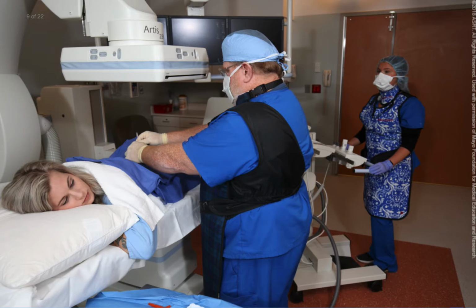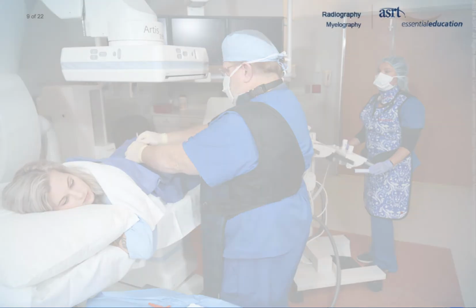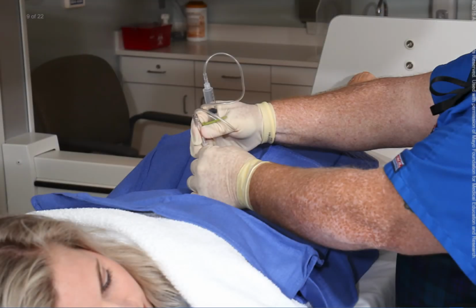To inject the contrast, begin a lumbar puncture as normal with the spinal needle. Once the subarachnoid space has been reached, cerebral spinal fluid will begin to flow out the needle. Attach the contrast syringe with connection tubing to the spinal needle with a wet connection by allowing a drop of contrast material to enter the hub of the spinal needle. Tilt the table approximately 15 degrees upright to keep the contrast in the lower lumbar area.